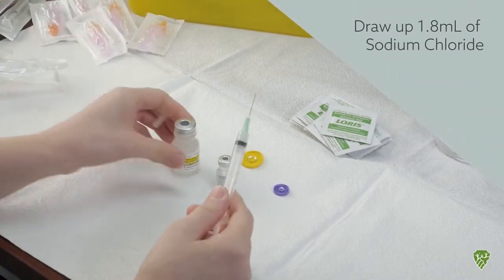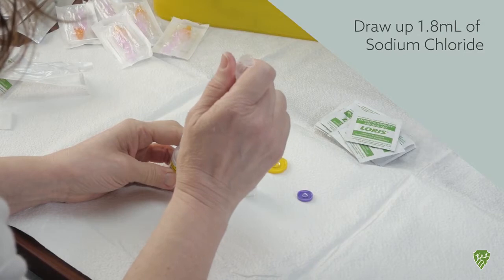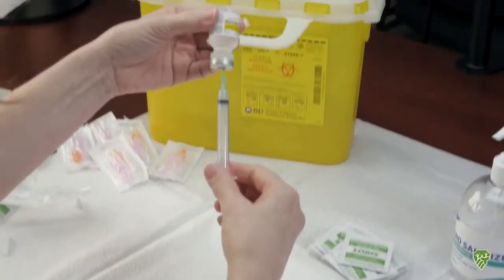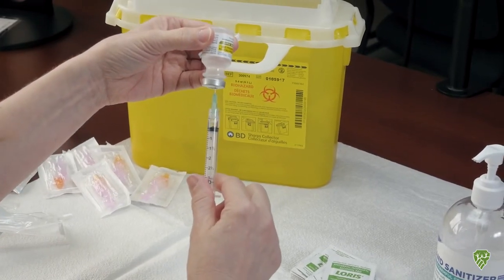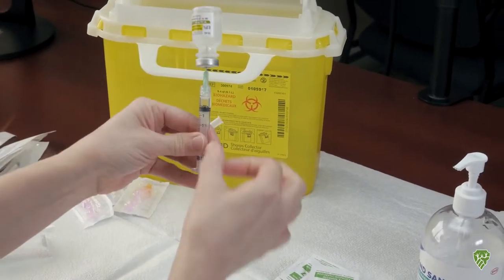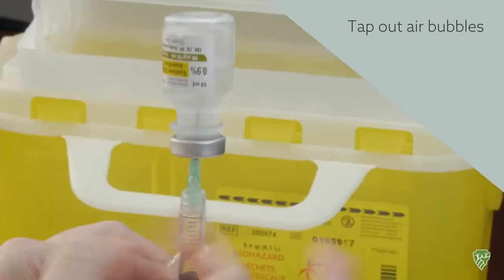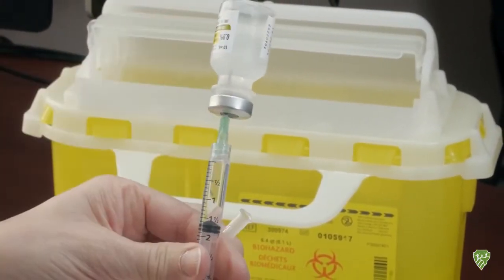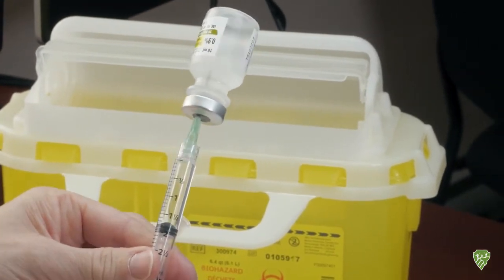Okay, so now I want to draw up 1.8 milliliters of the sodium chloride. And you want to tap out any air bubbles and just make sure all of the air bubbles are out, bringing it down to exactly 1.8.